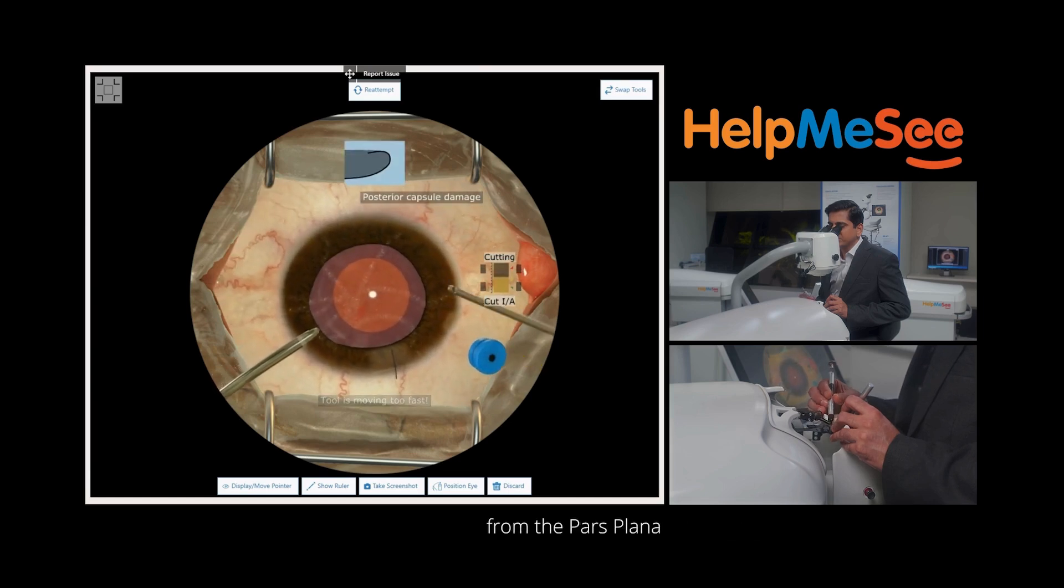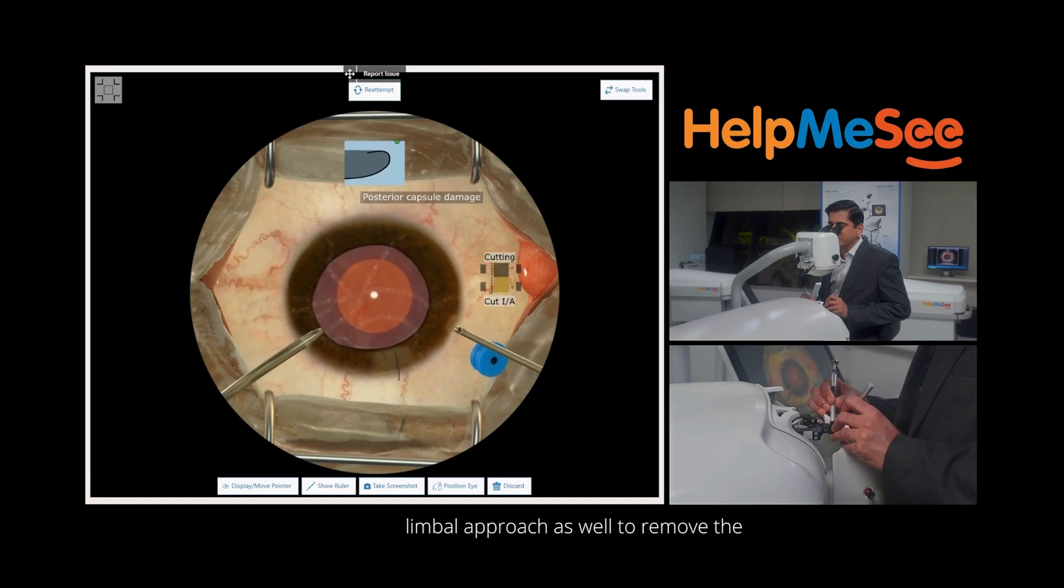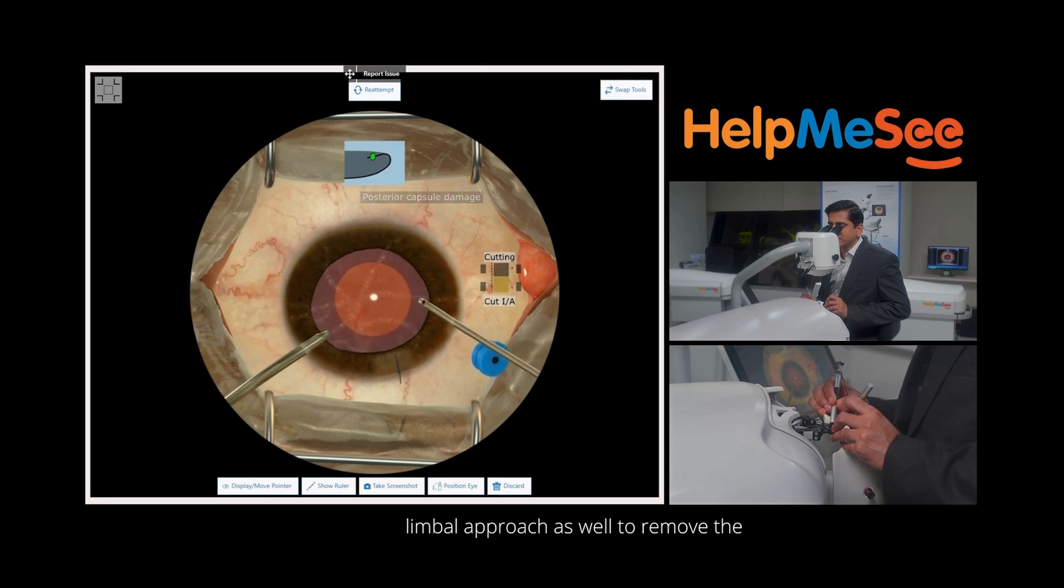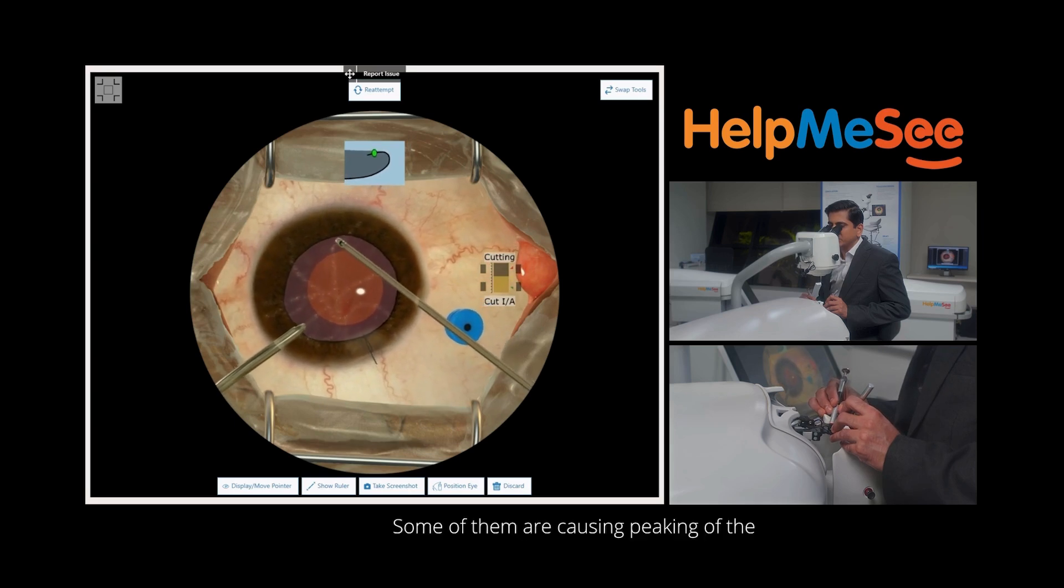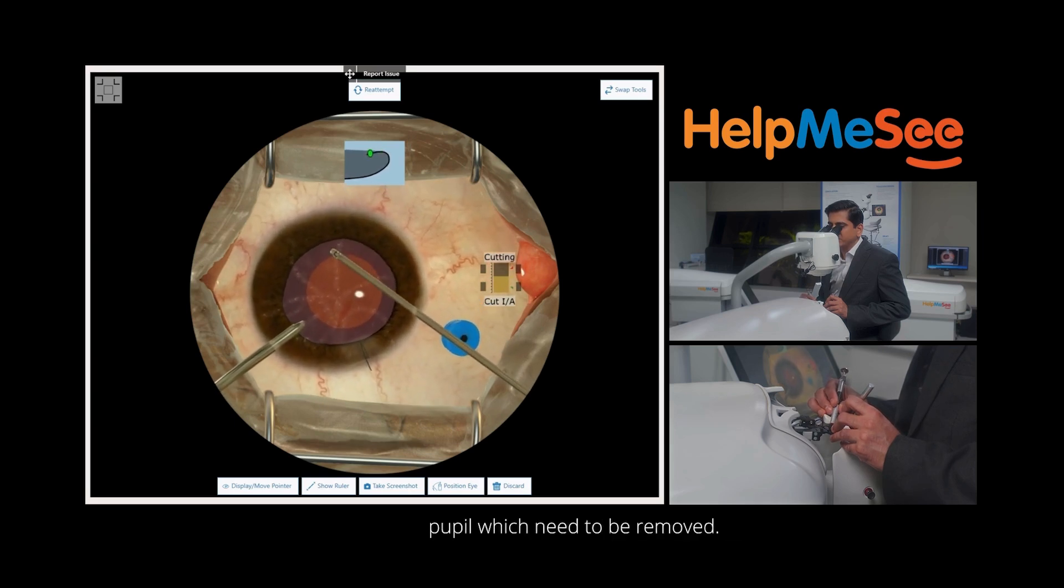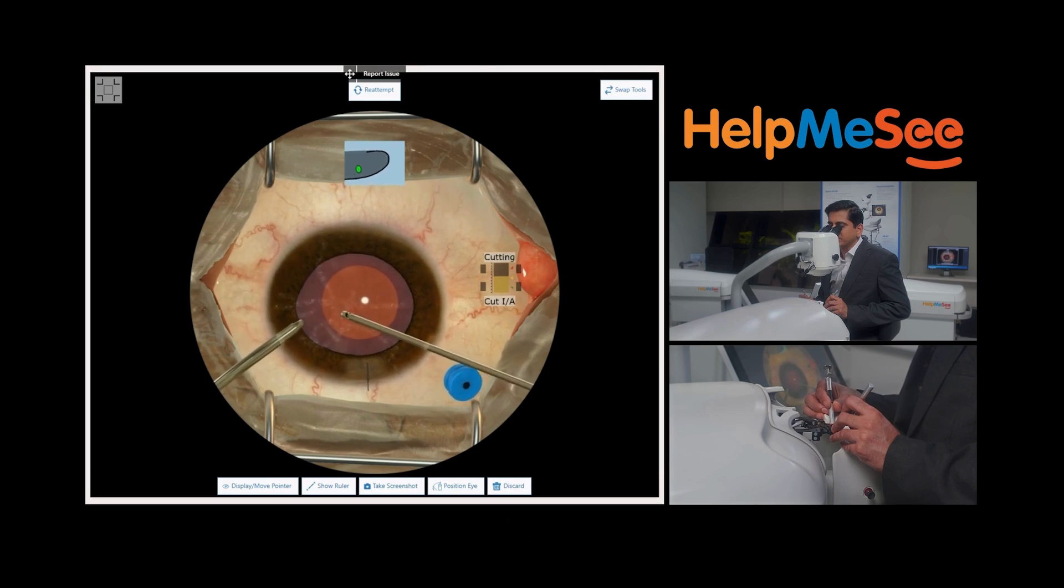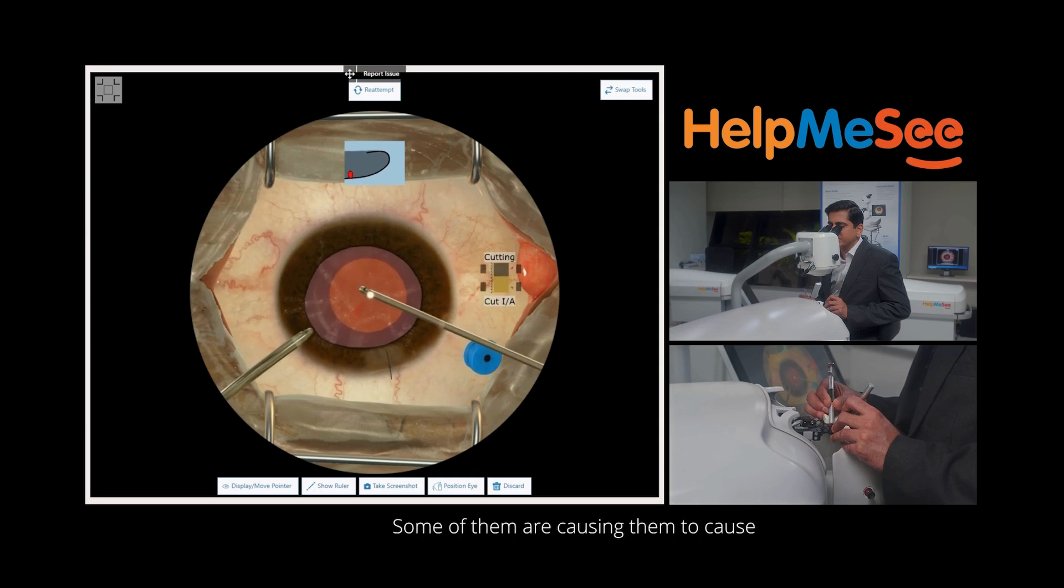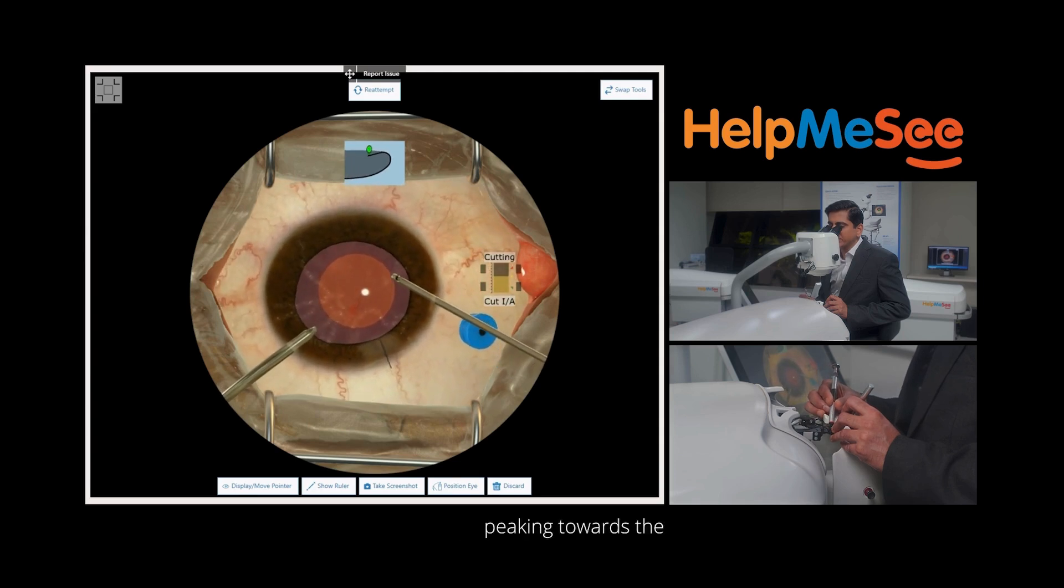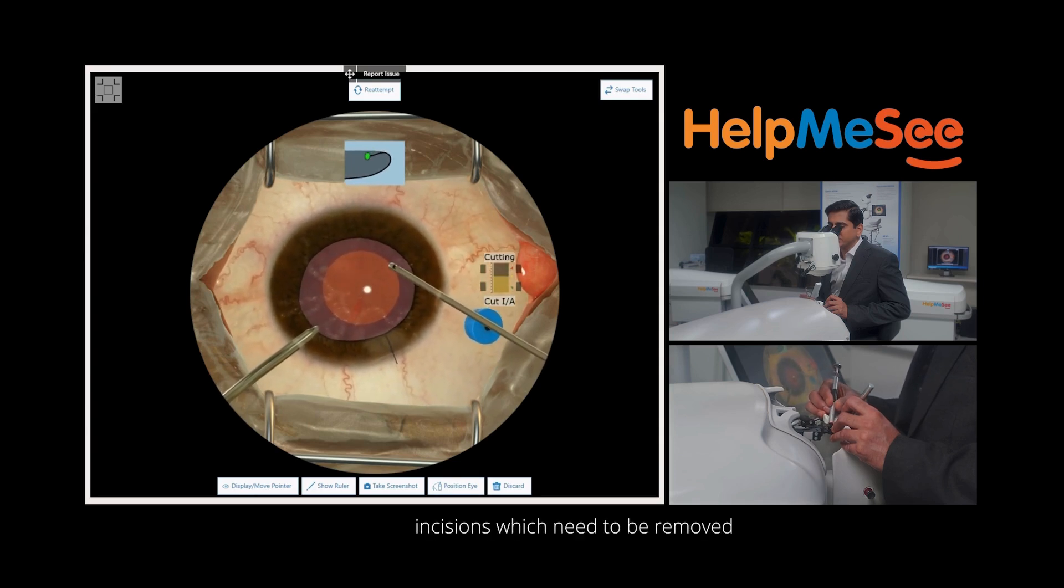Once we have removed sufficient vitreous from the pars plana approach, we can use the limbal approach as well to remove the strands which are free floating into the anterior chamber. Some of them are causing peaking of the pupil which need to be removed. Some are causing damage to the incisions and peaking towards the incisions which need to be removed as well.